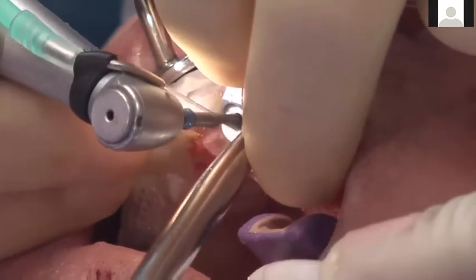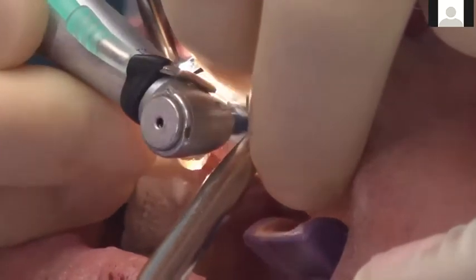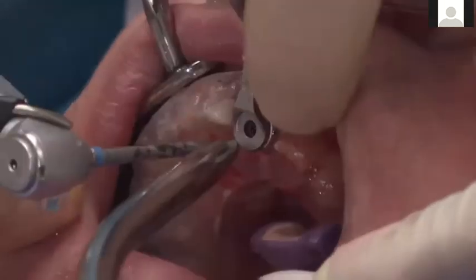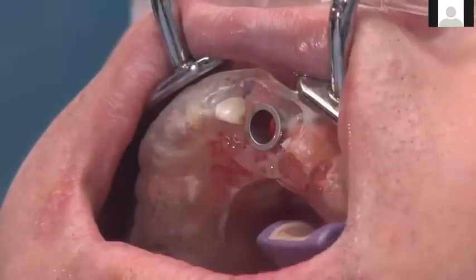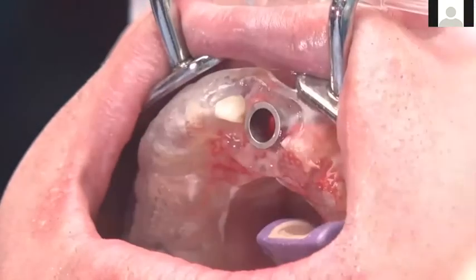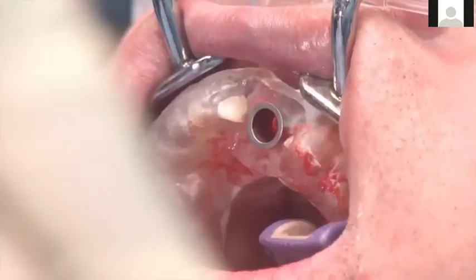And at this point, you just follow the protocol here. Once you do this, just make sure that you don't do it fast. Just go in with pumping motions in and out. That way you can get water as a coolant down into your osteotomy. Also important, between every osteotomy, either yourself or your assistant, make sure you rinse that osteotomy out with your chilled saline solution.